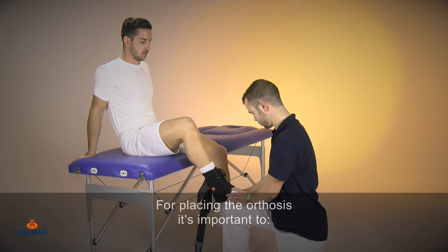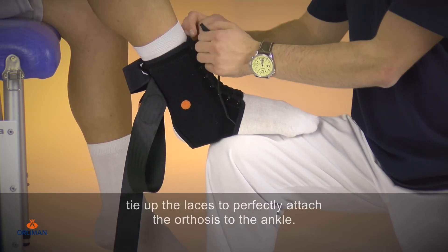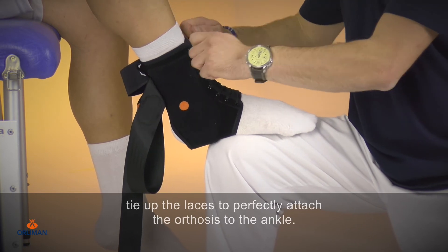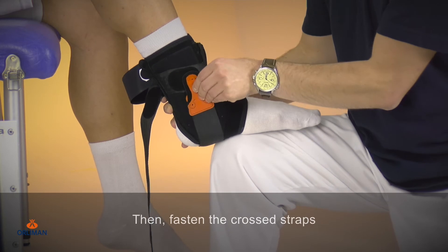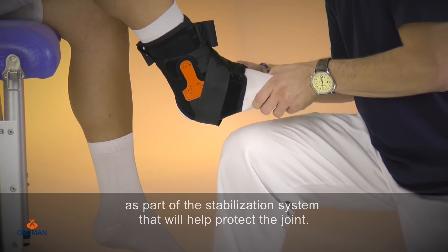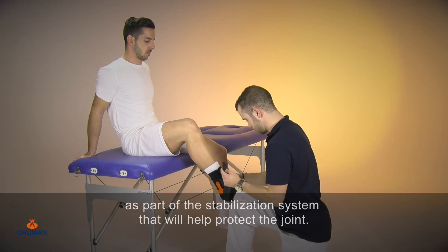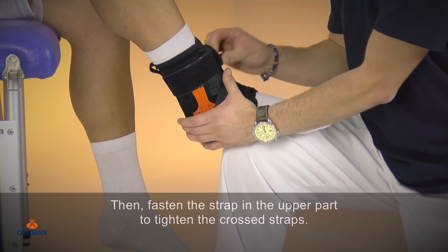For placing the orthosis, it's important to tie up the laces to perfectly attach the orthosis to the ankle. Then, fasten the cross straps as part of the stabilization system that will help protect the joint. Then, fasten the straps in the upper part to tighten the crossed straps.